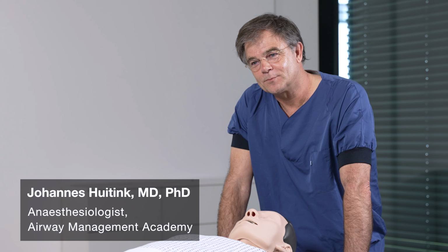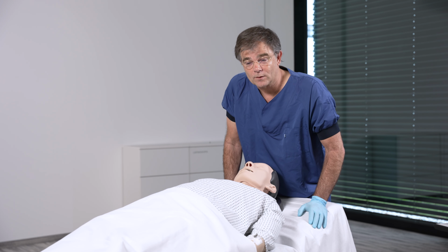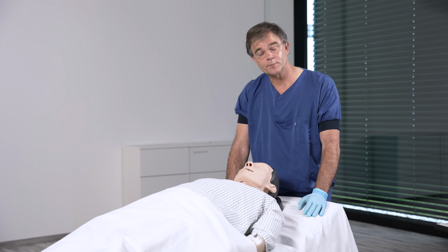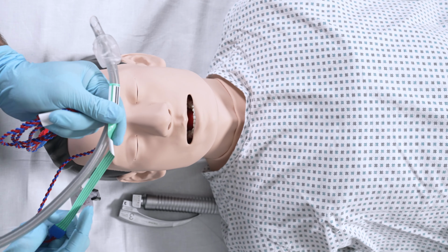I'm an anesthesiologist based in the Netherlands and also the founder of the Airway Management Academy. Today I will show you some tips and tricks about video laryngoscopy. I will show you how we use the video laryngoscope for tube placement.